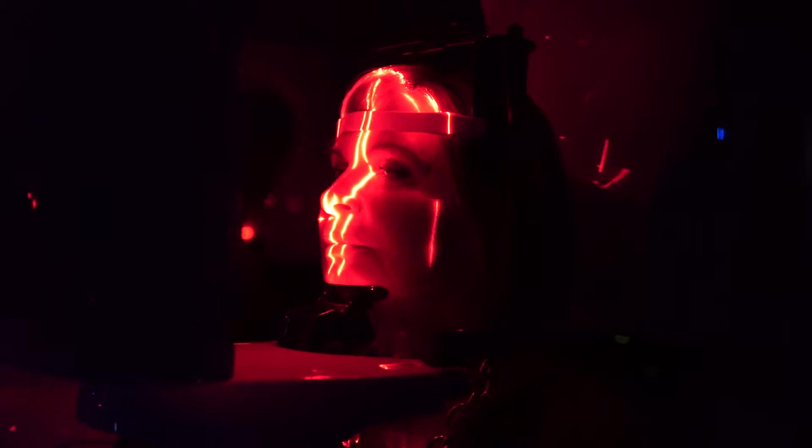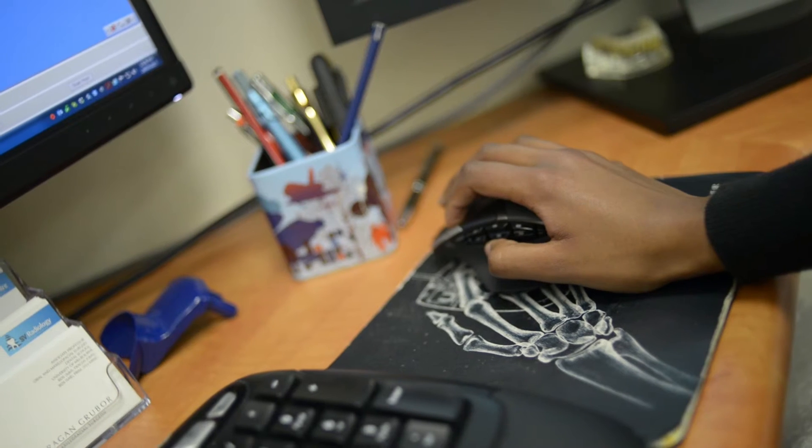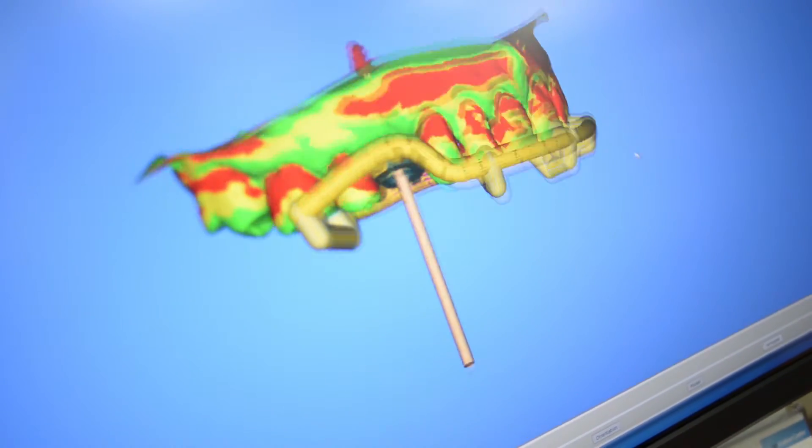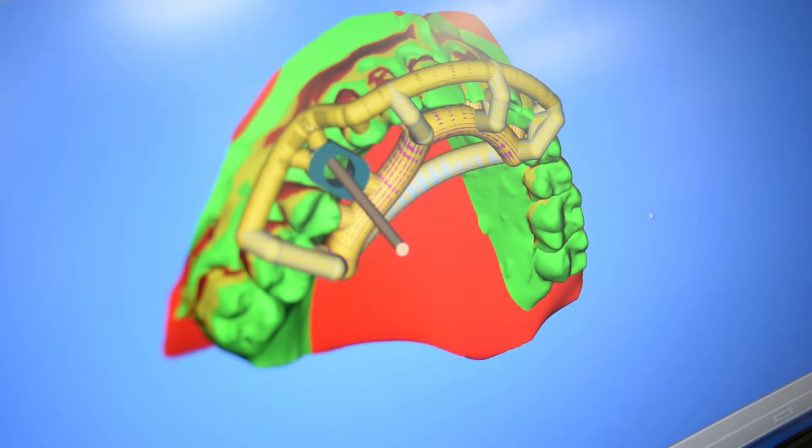Cone Beam Computer Tomography is a type of radiograph commonly referred to as a CAT scan. This is a type of radiograph that gives a three-dimensional view of the area to be examined. It is used to identify pathology, anatomical features required for treatment, such as root canals when carrying out endodontics.